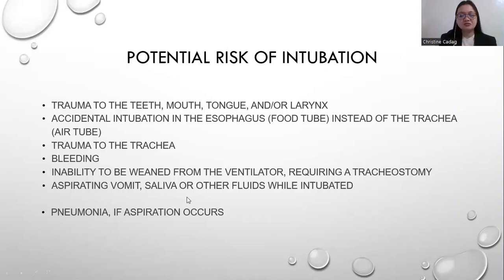So that's why before intubation, the patient is kept NPO, or if there's any gastric content, the nurse will remove it. So the patient will not vomit during intubation. Also, if the patient is vomiting, the patient might aspirate, and this may cause pneumonia.